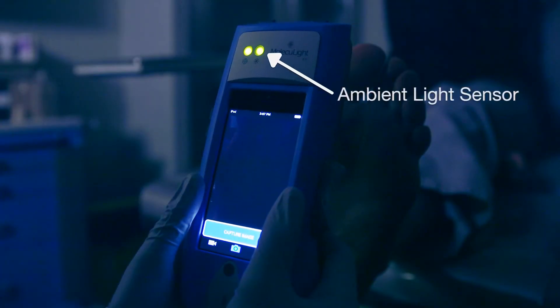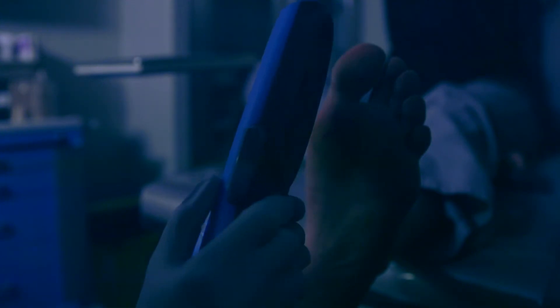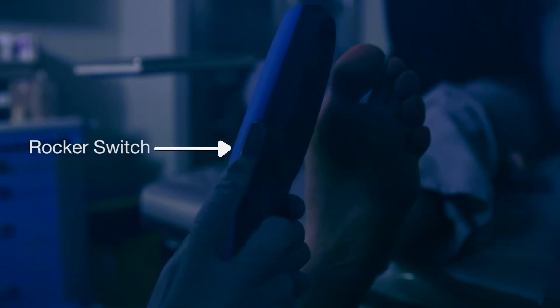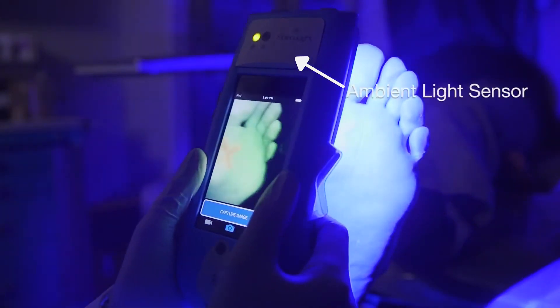Check the ambient light sensor LED beside the target you were preparing to image. When it's green, the light is optimal, meaning it's dark enough for fluorescence light imaging. Press the rocker switch down, and you'll see the ambient light sensor turns off.